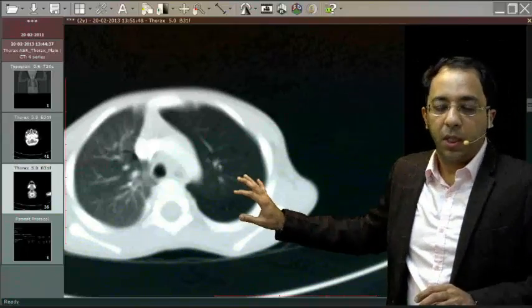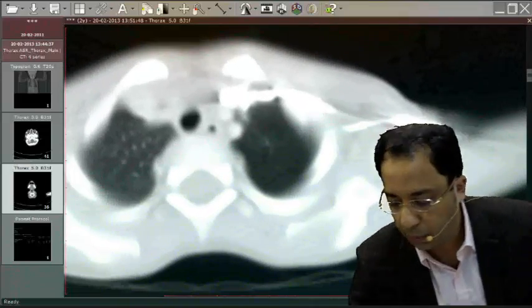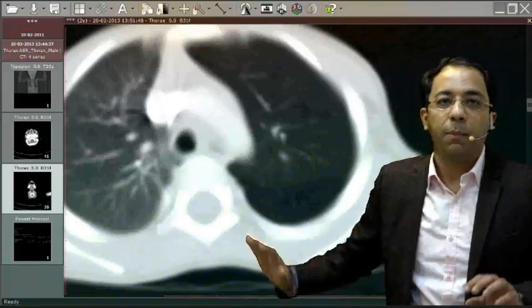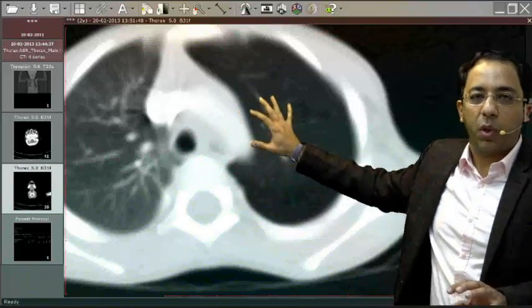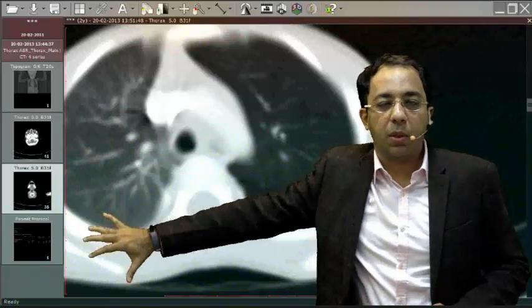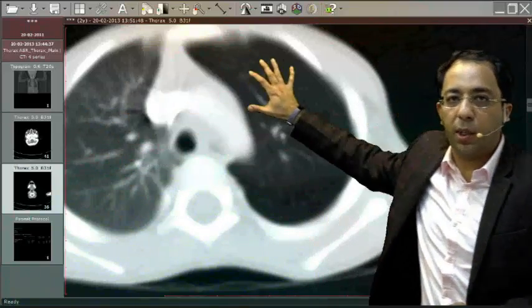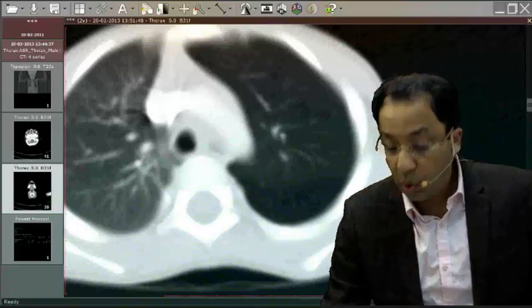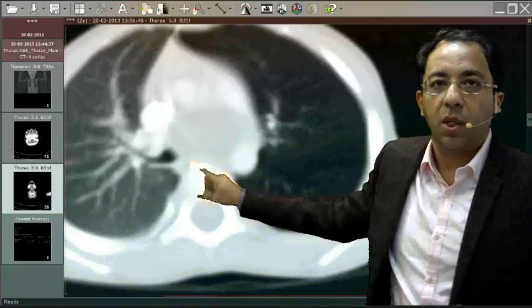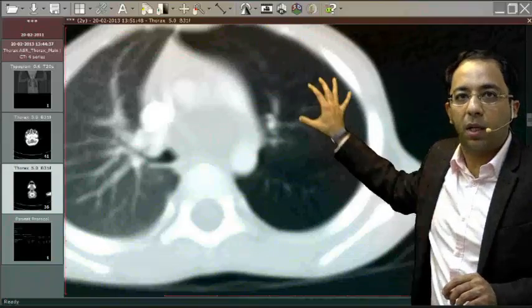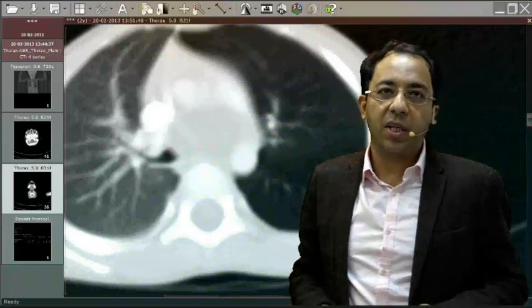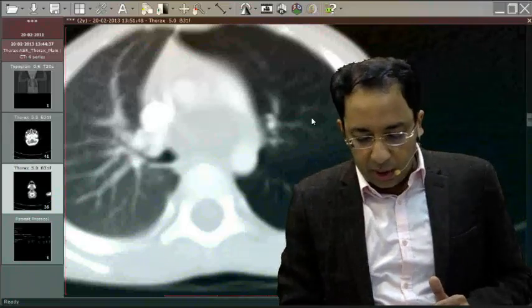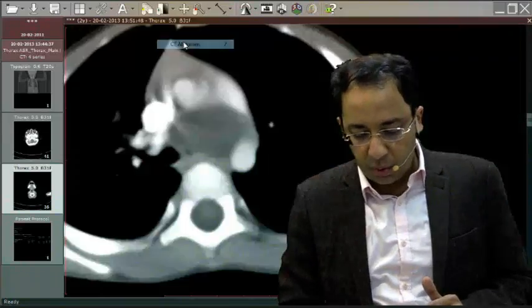As I go down, I'm zooming the image for you. I hope you can see that same difference, that the left thorax is hyperlucent. Look at the vascular markings here and look at the attenuation of the vascular markings here. But you don't see any clear-cut pneumothorax. There's no pleural line, there's no air separate. It's the lung itself which looks hyperinflated.